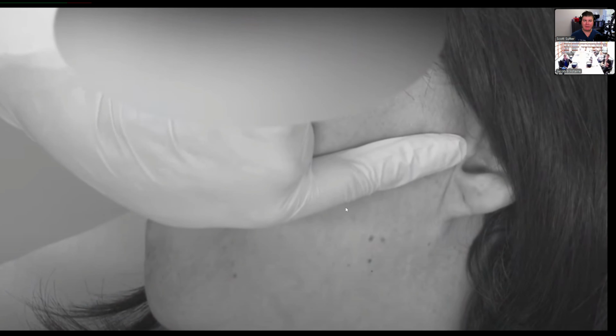So for your Gow Gates, the first thing you're going to want to do, we talked about proprioception last time. You're going to want to take your thumb, place it inside where your injection point is going to be, take your finger and put it right by the tragus of the ear. That's how far you need to go in. And the reason we do this is because this is a, we'll call it like a kind of an indirect technique of you don't have anything that you're hitting. You usually don't hit bone with the Gow Gates unless they have a giant lingula. But this tells you how far you have to inject.